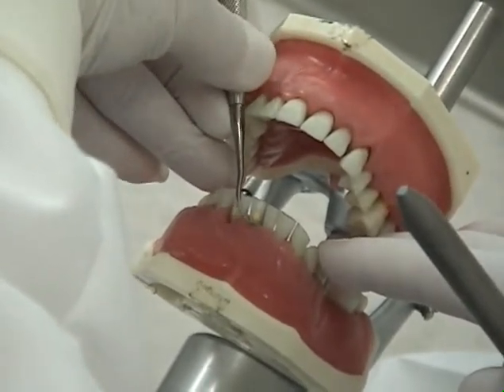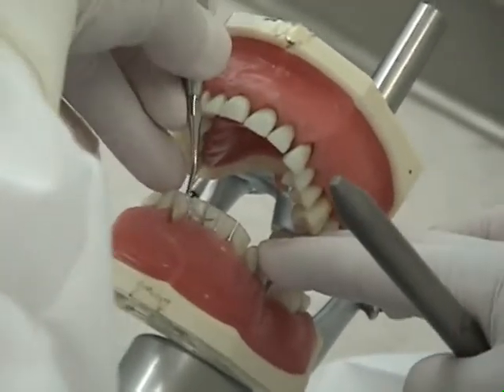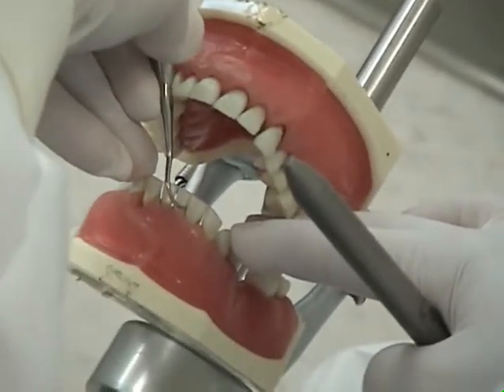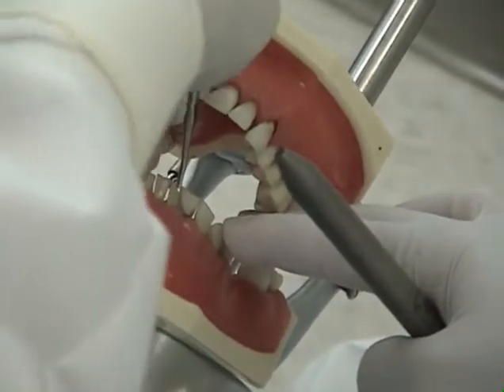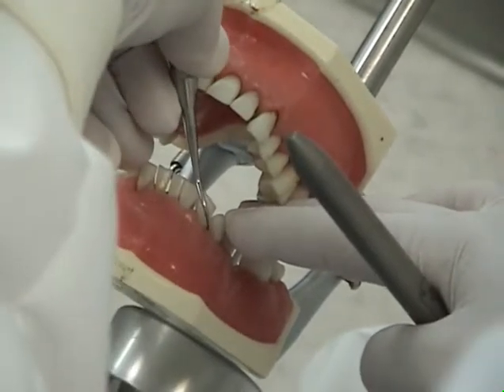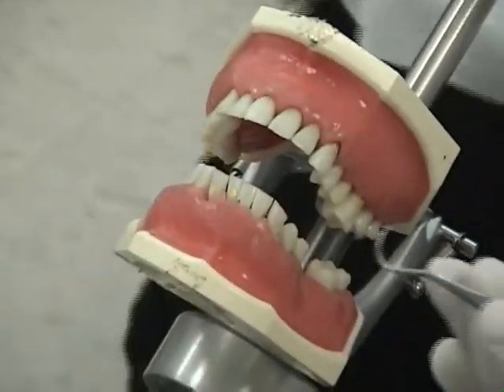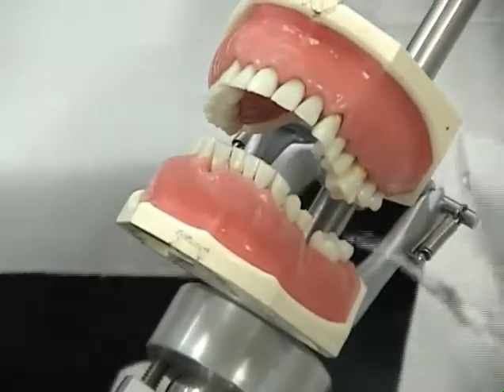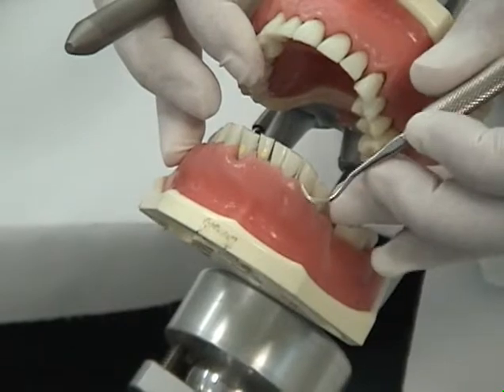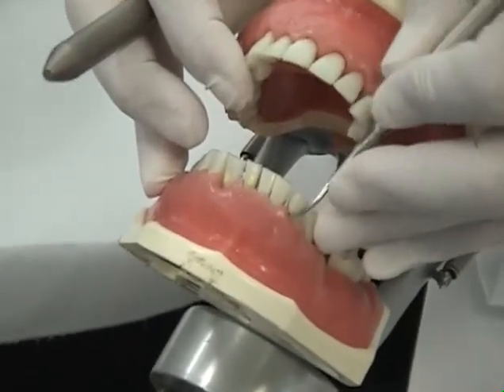Relax your fingers between each stroke. Continue on all surfaces toward you, ending on the left canine. Change your clock position and working end of the instrument and complete the remaining facial surfaces away from you, beginning with the left canine and ending with the right canine. Remember, the bend of the lower shank is toward you now.